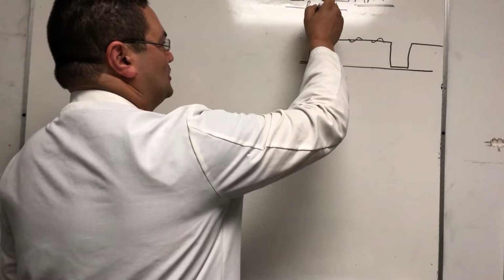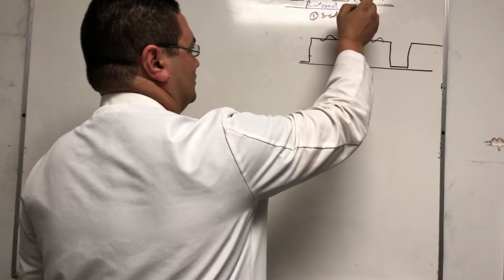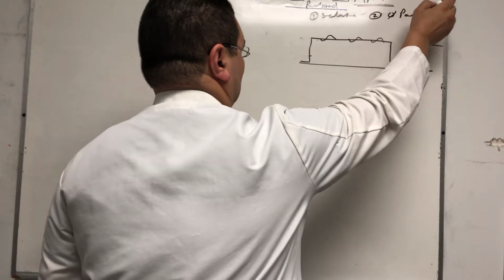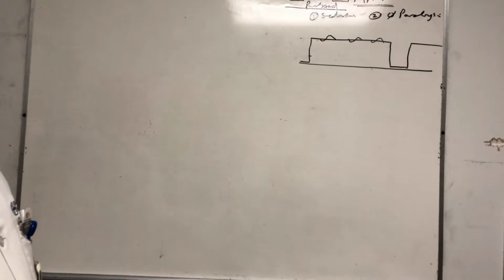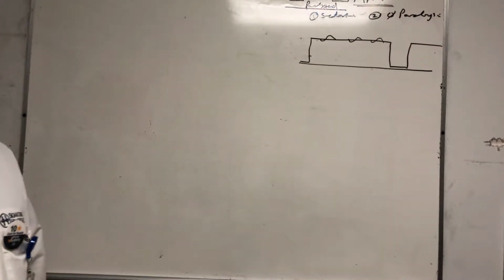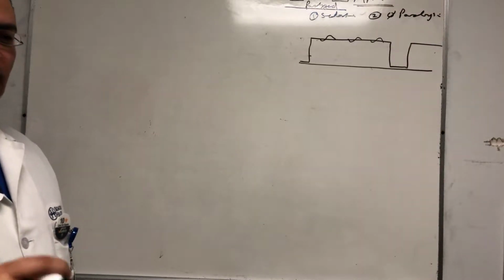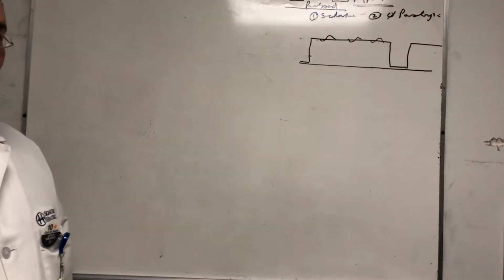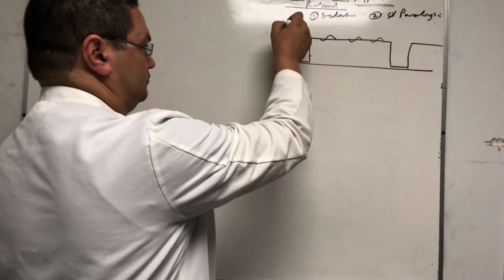So we talked about how it requires less sedation and doesn't require paralysis. These are two claims to fame we talked about. As we know, for every mode of ventilation that we study or learn about, we have to ask about the set parameters, the dependent parameters, and the waveforms. So this is the pressure waveform now.